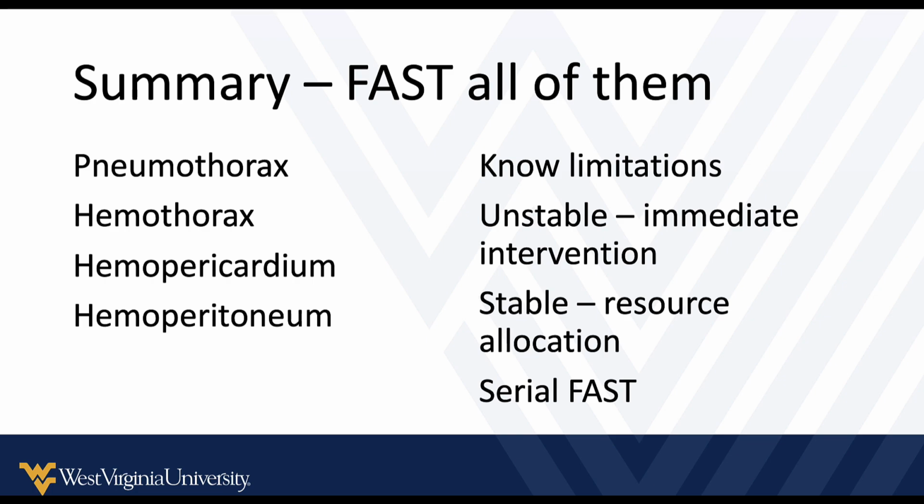In the stable patient, the FAST exam can help you make decisions, especially when you're dealing with multiple patients. In trauma scenarios, there are always other patients around that we're dealing with. We can decide who's the sickest and who needs the most attention and anticipate something going wrong before it does by incorporating the FAST exam with our history and physical.